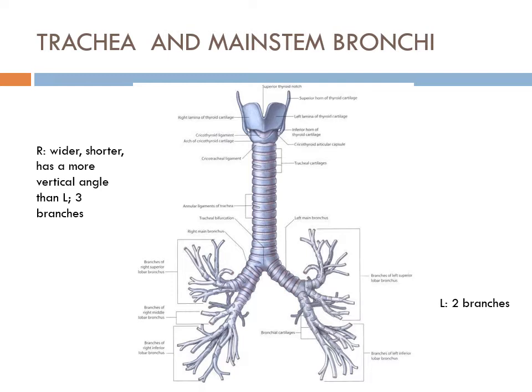The reason for that is that the bronchial tip of the double lumen tube has to go slightly into the actual bronchus. Again, in order to isolate it, you need a cuff which blows up, right? If I were to put in a right double lumen tube, I have a good chance of the tube and the cuff possibly occluding the right upper lobe, because the distance there is about 2.5 centimeters from here to here, and it's about 5 centimeters on the left side. So you have a very small amount of room to work with. And now think about this.